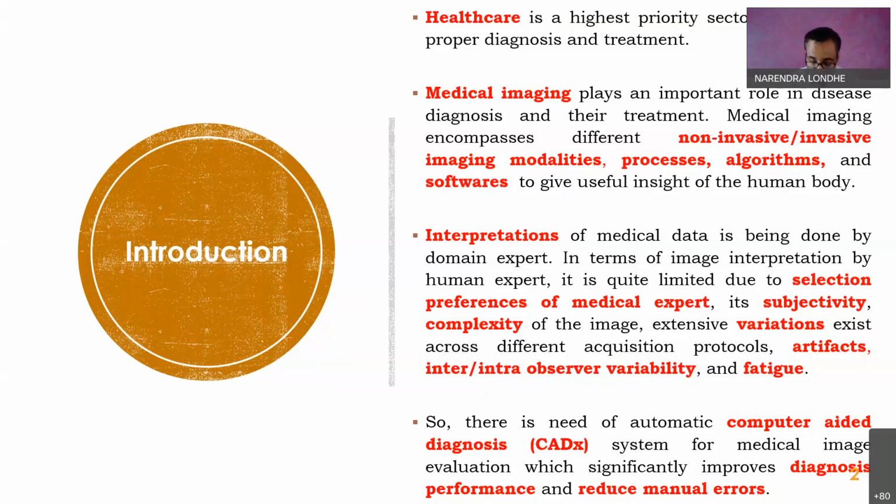And that is why it is really important in the domain of medical imaging that we develop some CAD system, means computer diagnosis system, where the computer will be able to diagnose directly from the images, without any interference from the radiologist.